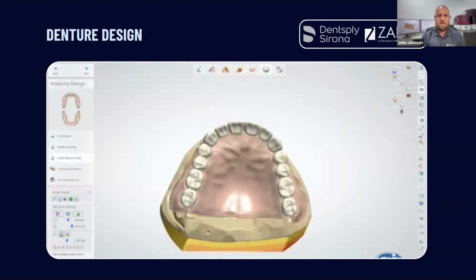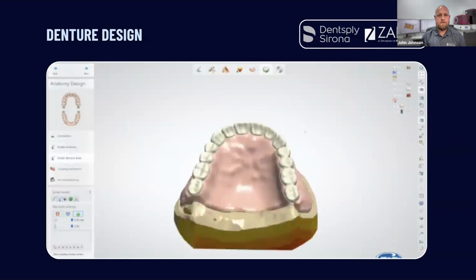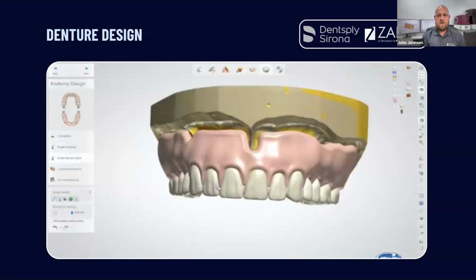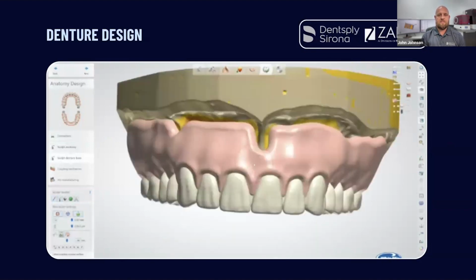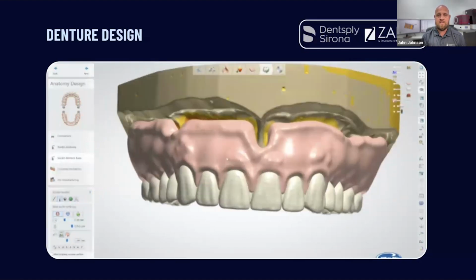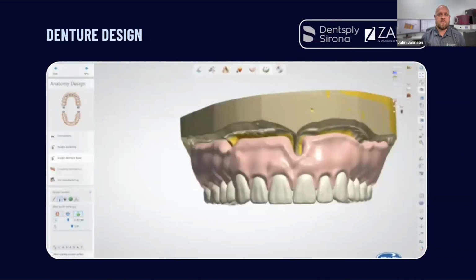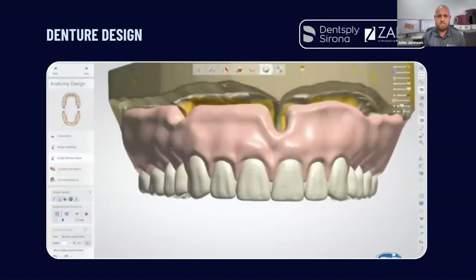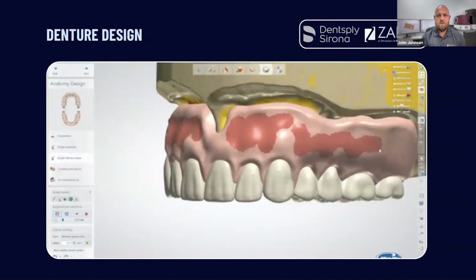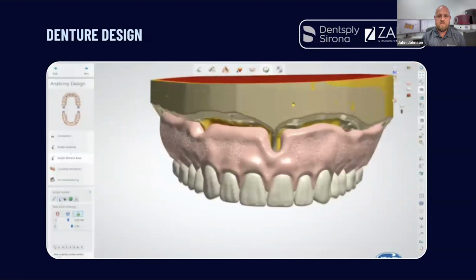Some rugae characterization because I can see through the denture. It's a really cool feature, depending on your clinicians. And you're able to manipulate this just like it was wax. Once you get used to it, like I said, I'm not crazy computer savvy, and there's things that you can do. There's endless amounts. You could write your name in this denture if you'd like. There's stippling options. I don't stipple a ton, but if you wanted to, it's there.